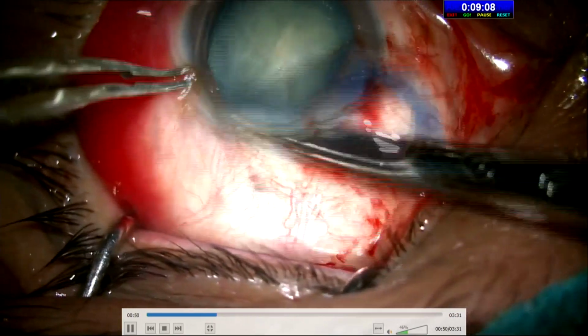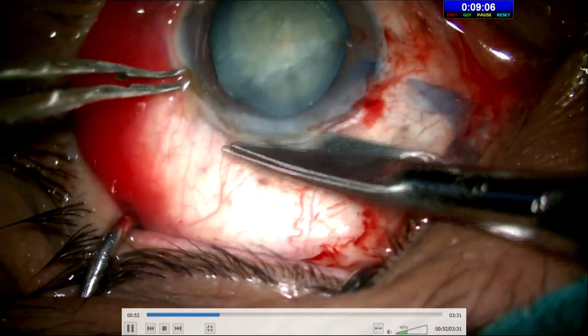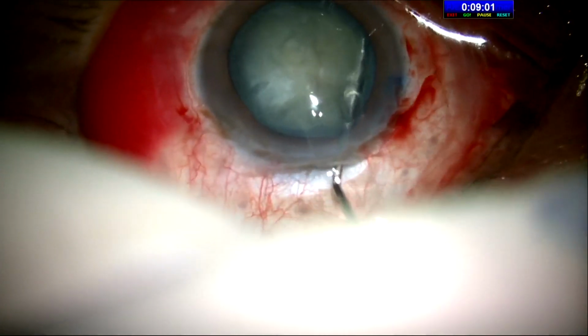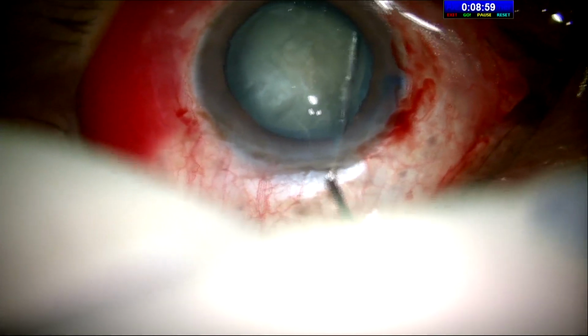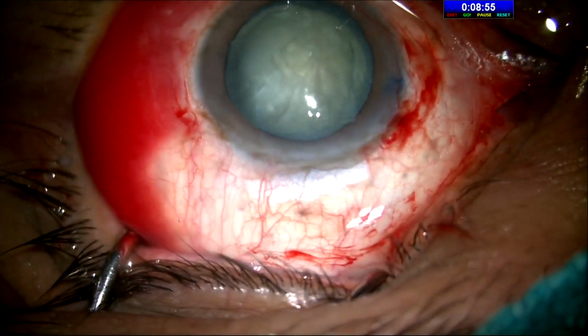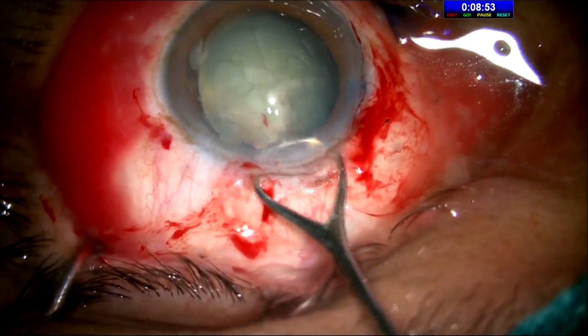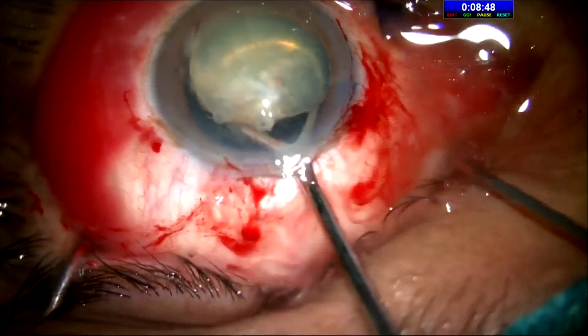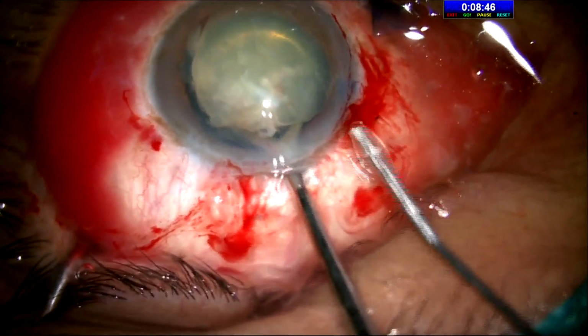So this is just an 8 millimeter incision, limbus only, and no conjunctival flap, a little hydrodissection, so that the nucleus is freed. You don't have to rotate it. You can take it out by the sandwich method. You can flow it out with the visco.